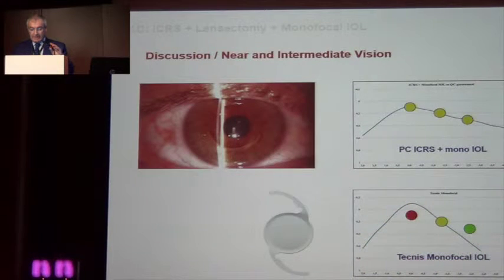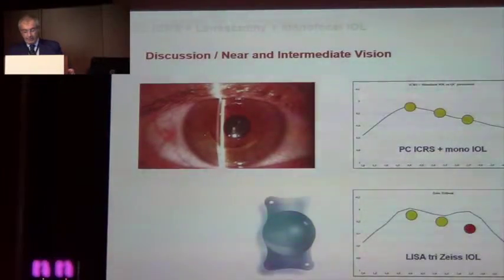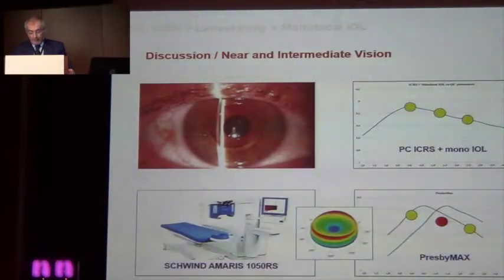Our first surprise is that the near vision is better than expected with a monofocal IOL, and so, the lens being monofocal, the corneal profile obtained has to be responsible for the near vision. The defocus curve is similar to the curve of a trifocal implant for the far and intermediate foci, but worse for the near focus. And the far vision is also similar to that obtained with a presbyopia correction, specifically with the defocus curve of the distance vision of a presbyopia treatment.